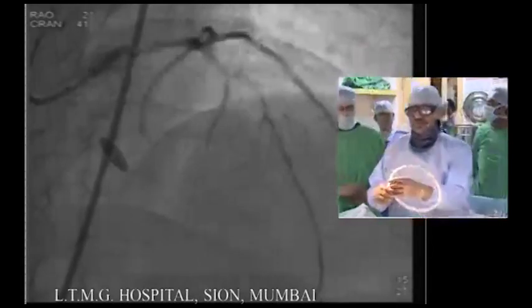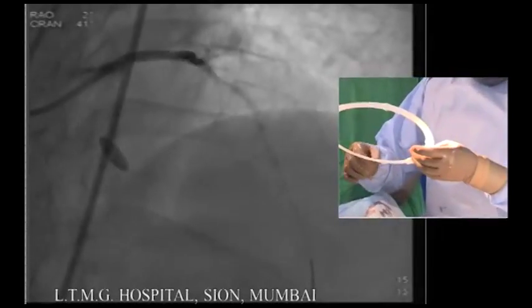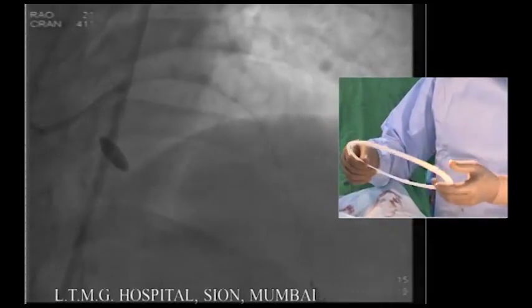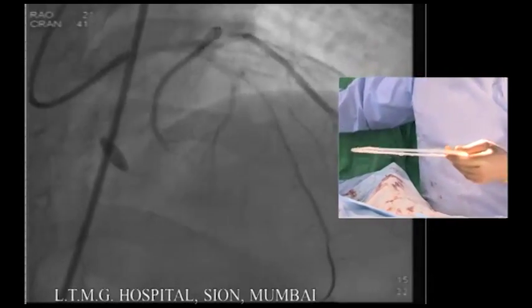So we are using a 6 French guideliner. So balloon ready. So 2.75.